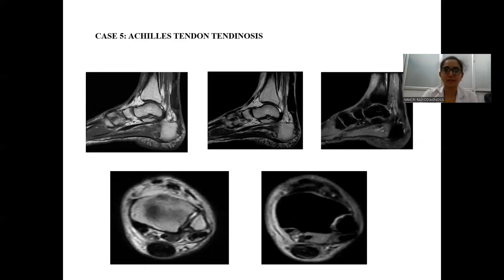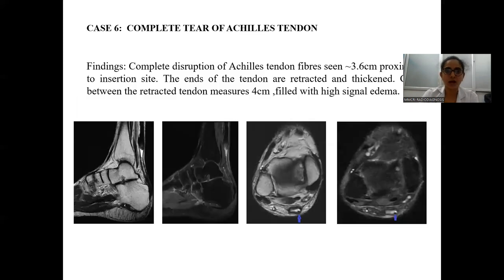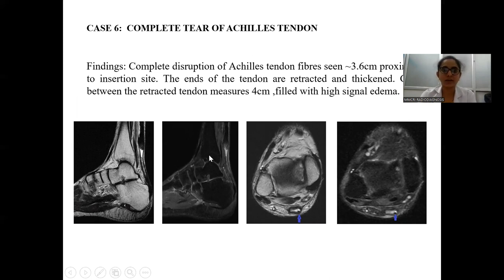The next case demonstrates Achilles tendon tendinosis. The following case shows a complete tear of the Achilles tendon with complete disruption of the Achilles tendon fibers measuring approximately 3.6 cm in length at the calcaneal insertion, well appreciated on PD images. The retracted tendon gap is filled with high signal intensity edema.